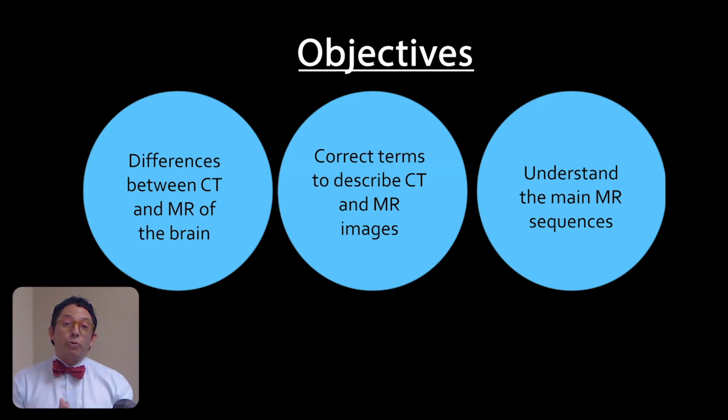so you can differentiate them. This is very important because, as you can understand, it is almost impossible for us to know what is really going on inside the morphology of the brain unless we open it up. Fortunately, we have tools to avoid that, which are diagnostic images. So that's what we're going to be talking about today.